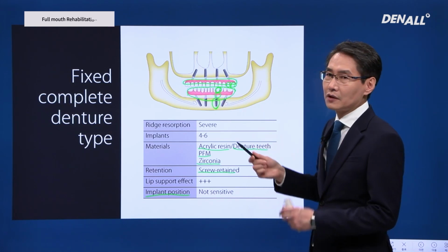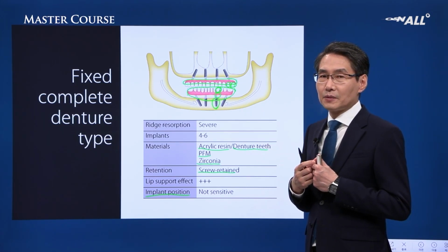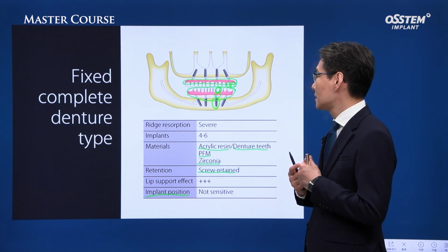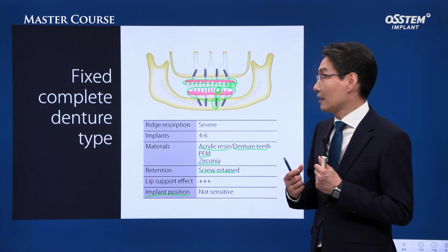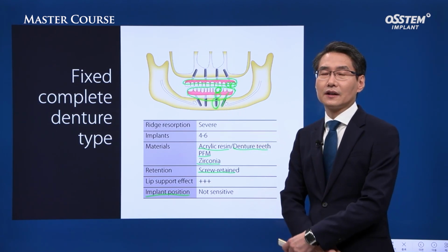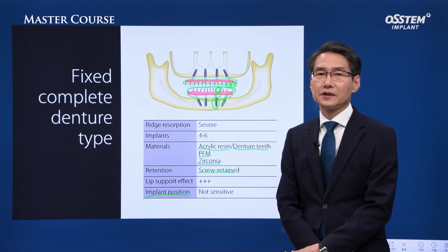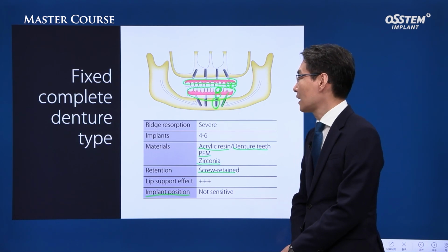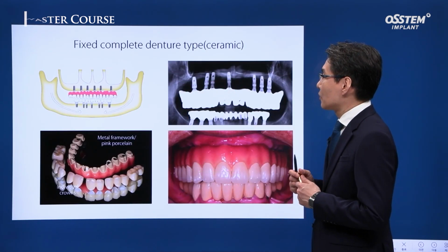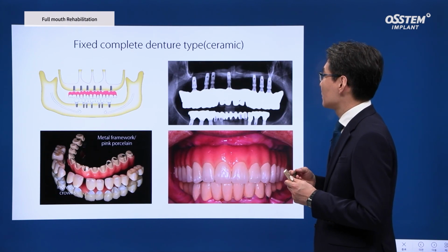Even if you do not achieve that goal because there is mesostructure, in terms of prosthodontic restoration, you can feel less stressed. It is less constricted in terms of implant placement position. You can provide angulation or do a bit of customizing, use a screw abutment and such, you can be more flexible here.